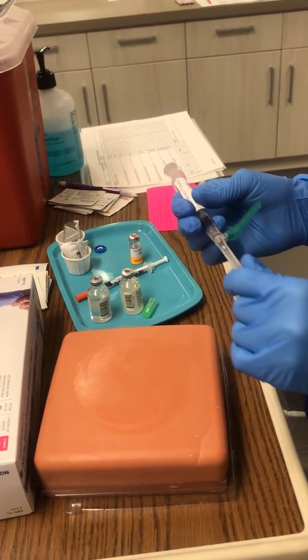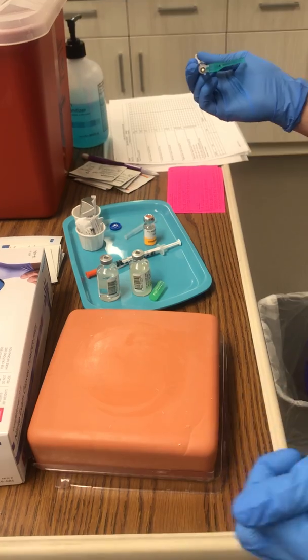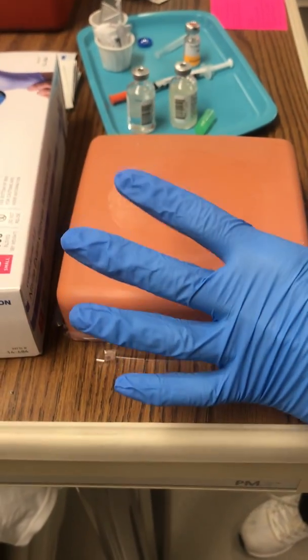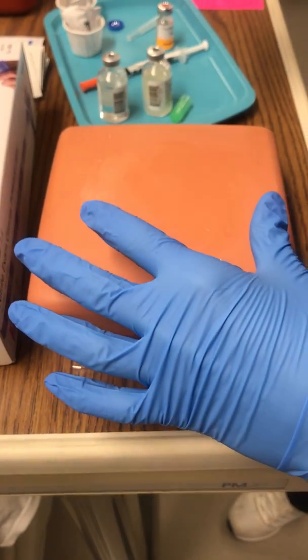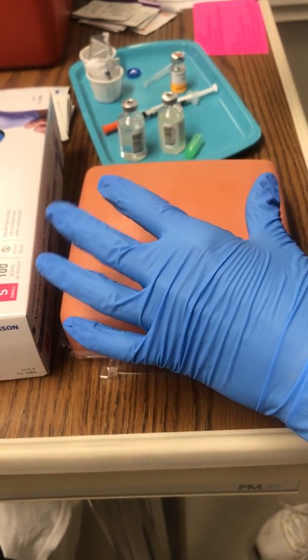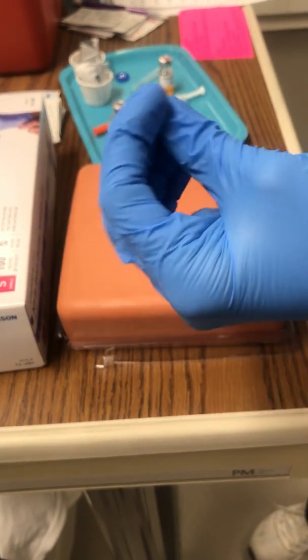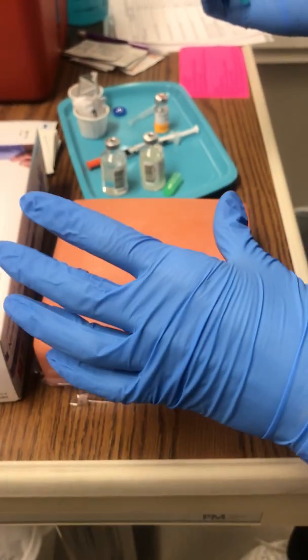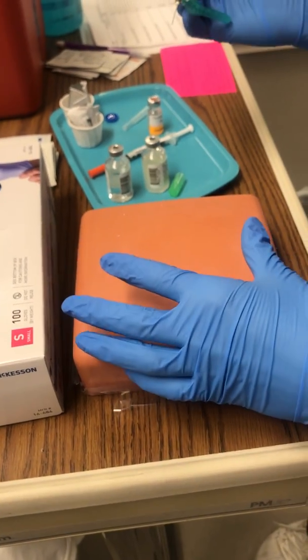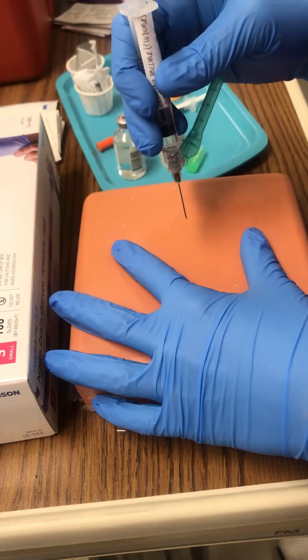I'm going to pull this cap straight off. Set it there. And then, let's see, wait for it to dry here for a second. So I felt the site for palpation, any bruising, swelling, anything abnormal, everything looks good. So I'm going to inject straight in. You might feel a little pinch here, okay?